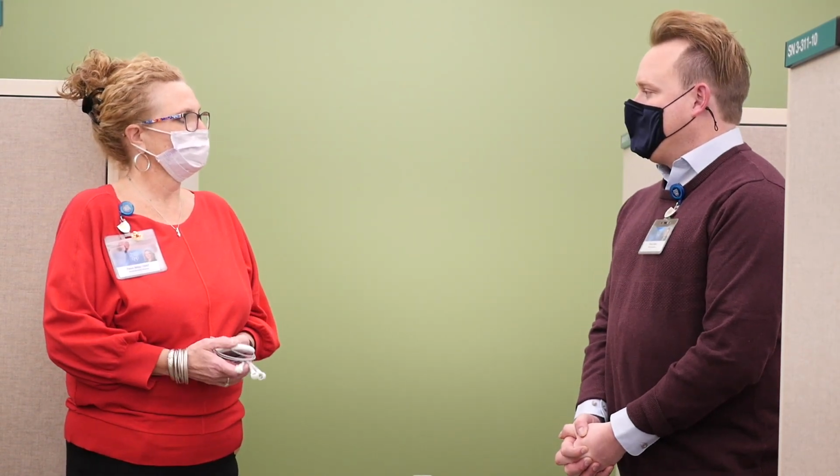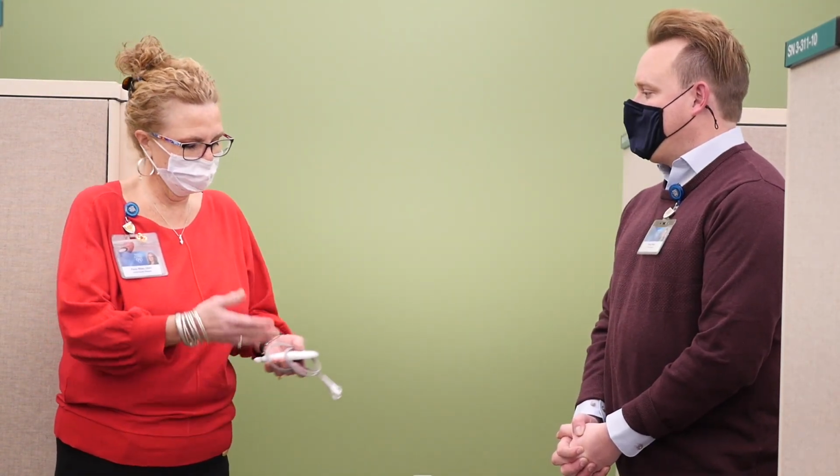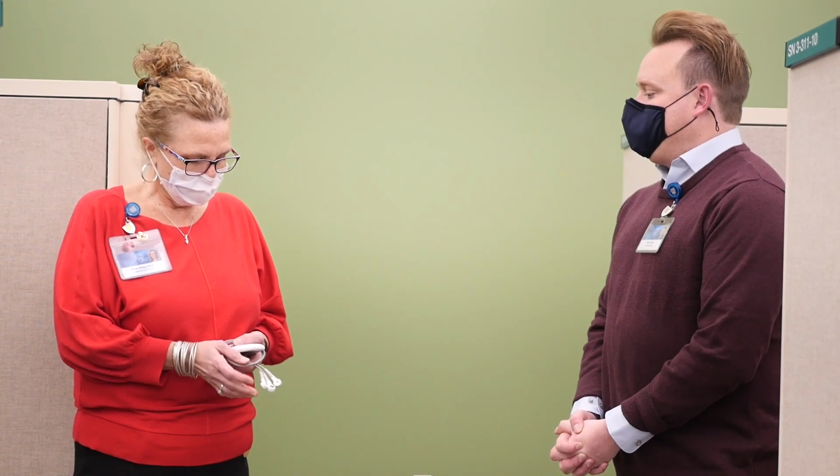Back in 2014, Mayo went to home monitoring because insurances didn't want to pay for people to stay in the hospital anymore, so they came up with this, and we've been through a couple of different kinds of devices now. So now a patient can go home. We can watch them at home for 30 days, 24/7. Other than when they bathe, they take it off. They take it off when they do that, or go swimming, because it's not waterproof.